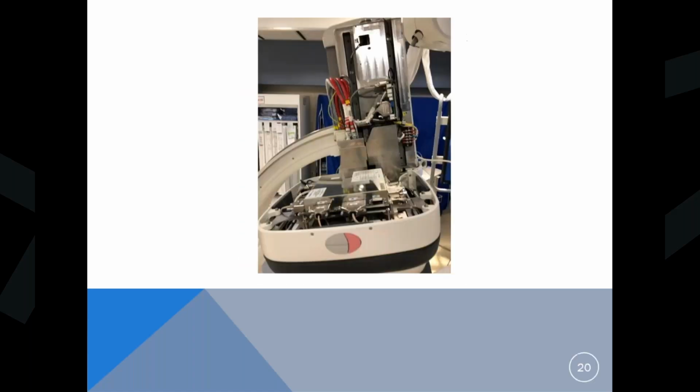Here's an unfortunate moment. So this is a broken digital detector. Kind of give you the inside. What we call inside the detector housing, we call it the pizza box. And that's where it houses all the electronics for the image producing from the digital detector. This one suffered an unfortunate incident. It ran into something from down below, and it took the detector offline. It took out enough pixels that it was no longer of viable image quality.